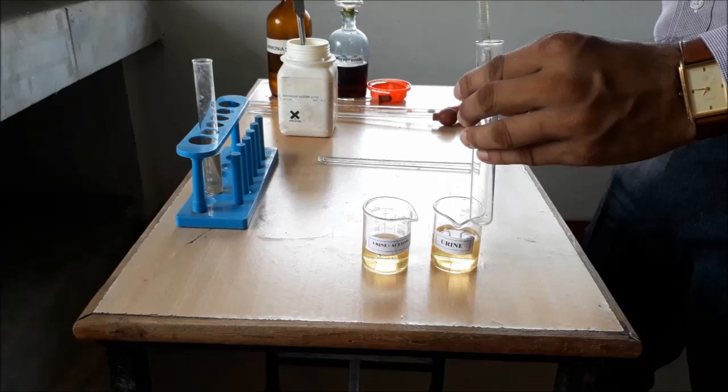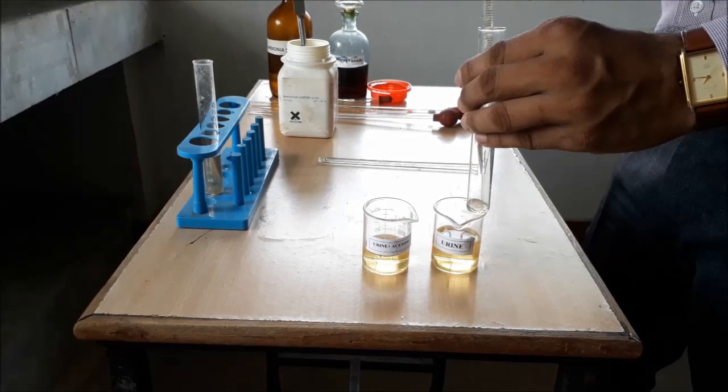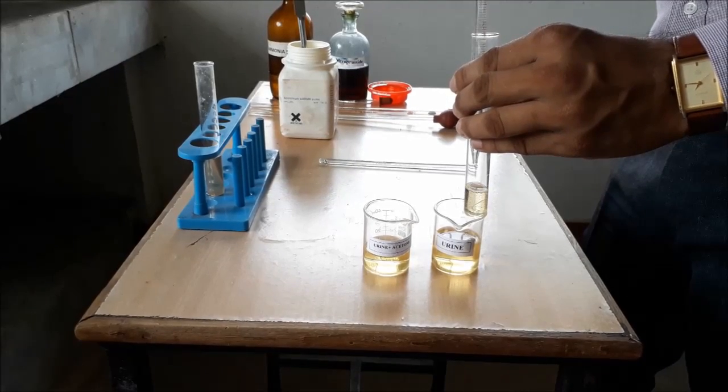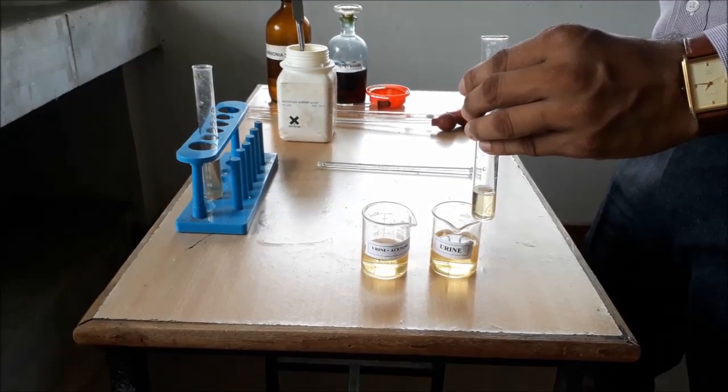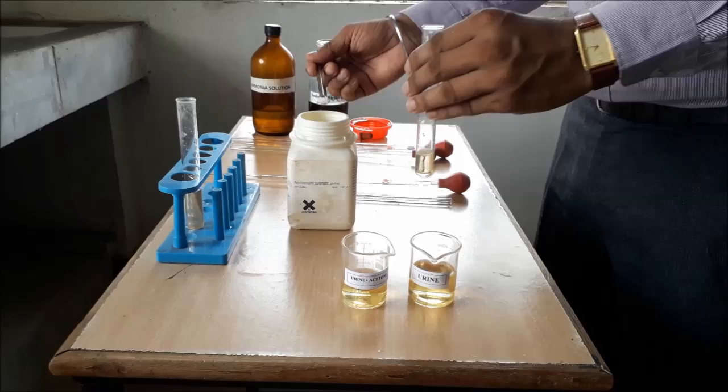Welcome friends. Today we will determine ketone bodies in a given sample of urine. To perform this experiment, pipette out 5 ml of normal urine sample of any individual and transfer it into a test tube.